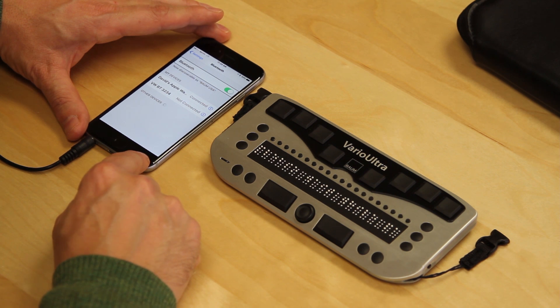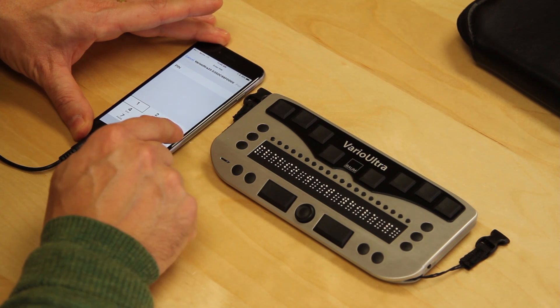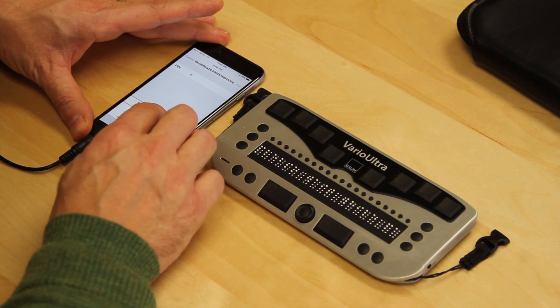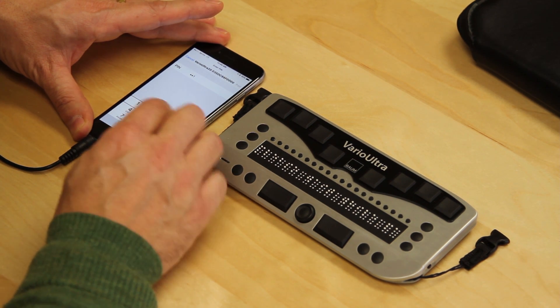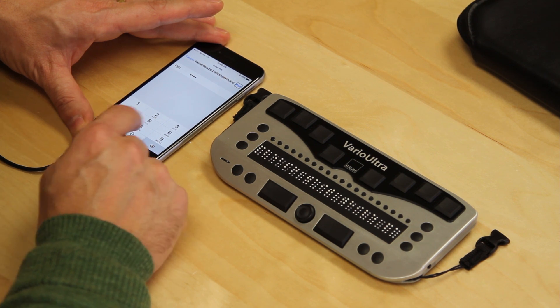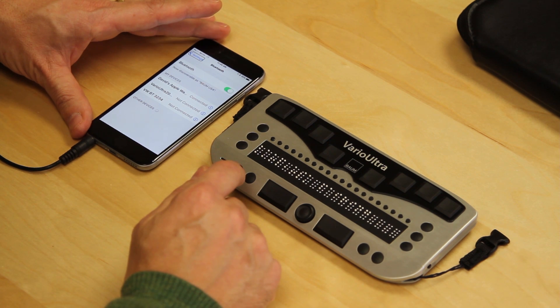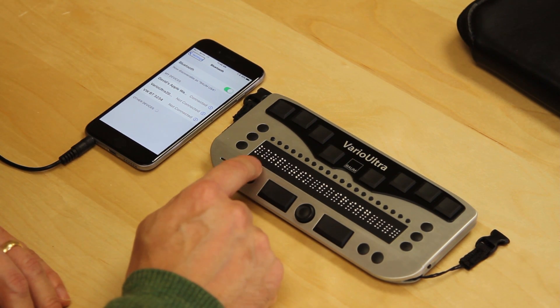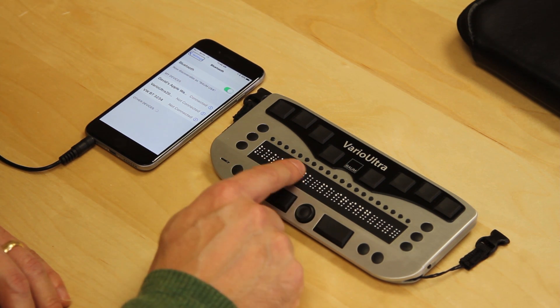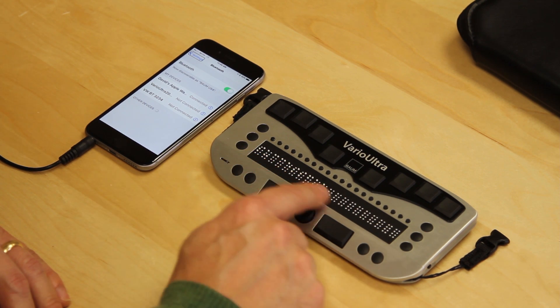I'm going to use one of the cursor routing buttons above the word pair to initiate the pairing request. The phone, meanwhile, is going to receive this and ask us to enter the pairing code. I swipe down to one, double tap once, twice, three times, four times, swipe left to go up twice. I get to pair, double tap. The pairing with the phone has been done as far as Vario Ultra is concerned, and it says BaumUSA pairing successful.